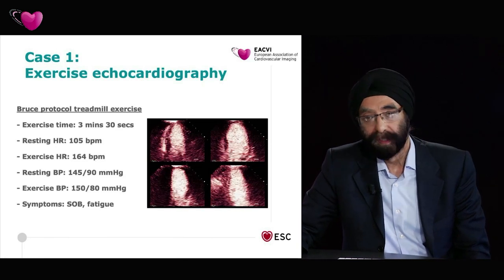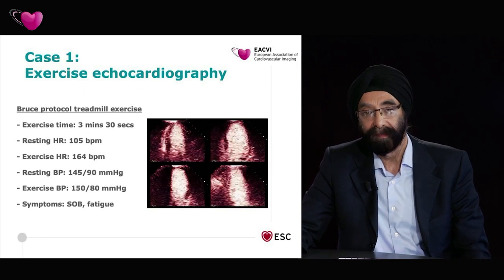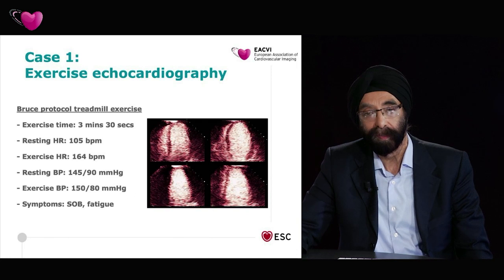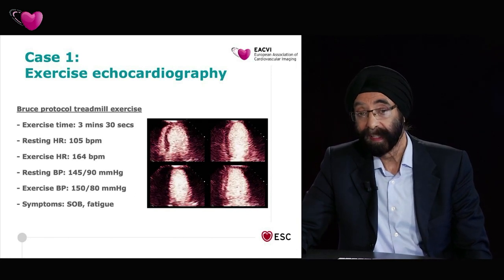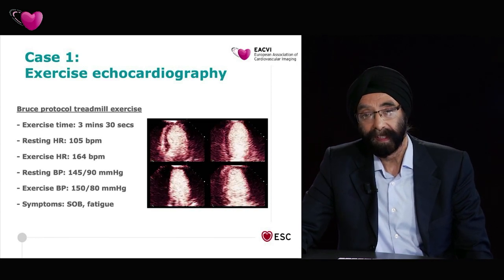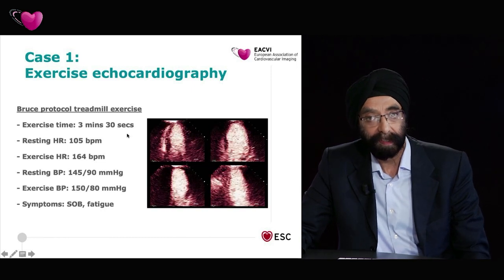So we proceeded to doing a stress echocardiogram. Now, many non-invasive imaging techniques have difficulty when you have a patient with left bundle branch block and markedly overweight, not ideal for SPECT imaging, not necessarily ideal for CT even if the patient is particularly overweight. So there are difficulties with non-invasive tests, but we generally like the functional approach.